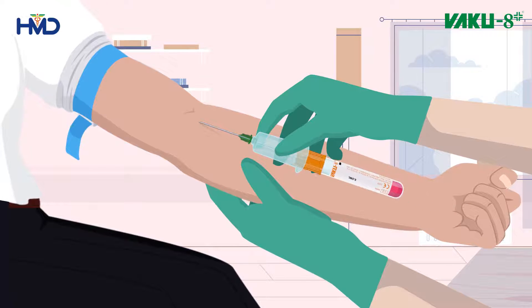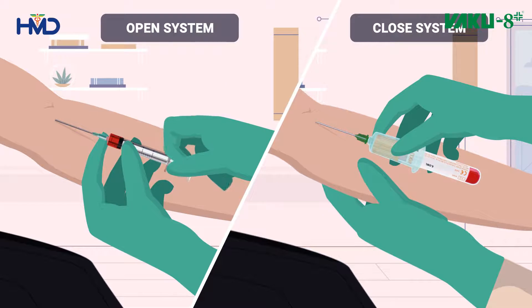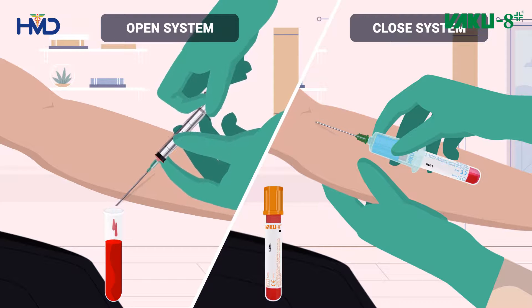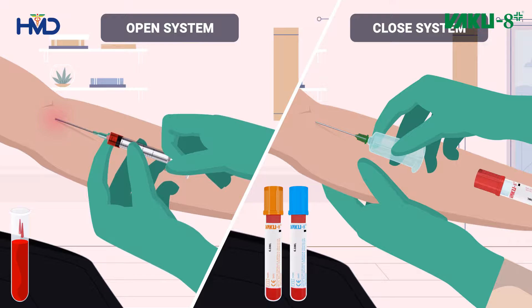Take a blood collection tube and insert it all the way into the holder. Unlike the syringe method, with VACU-8 you can collect multiple blood samples with a single insertion. This makes it a closed system. The blood collection tube is vacuumed in such a way that only the desired quantity of blood is collected.